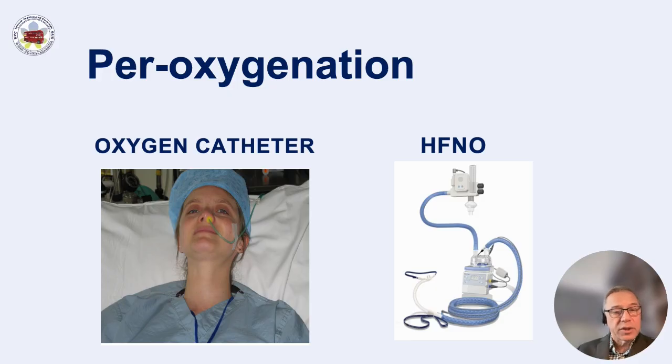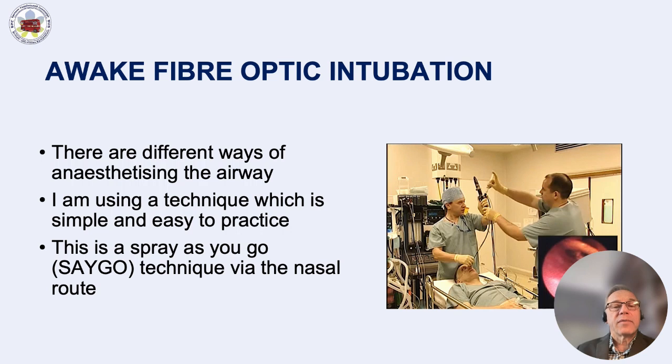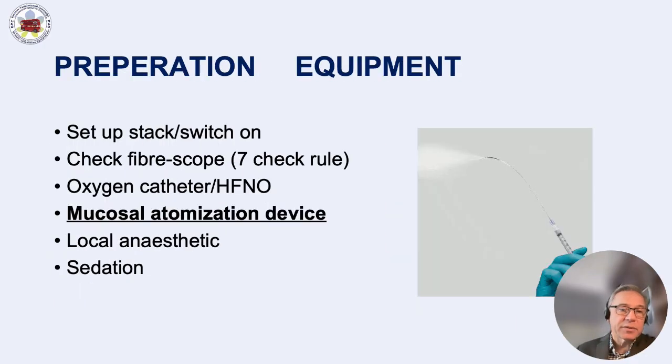Okay, there are different ways of anesthetizing the airway, and I'm using the technique which is simple and easy to practice. We call it SAGO, spray as you go technique, and usually we prefer the nasal route because it's more easily tolerated by the patient.